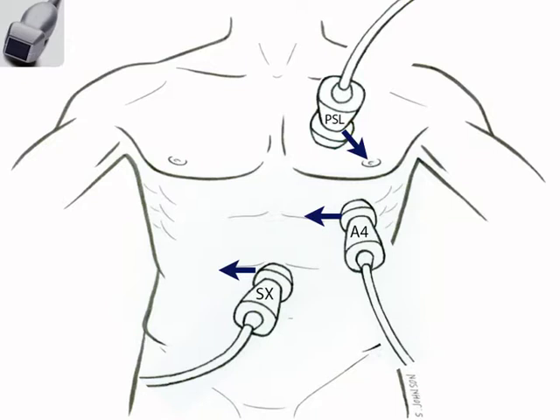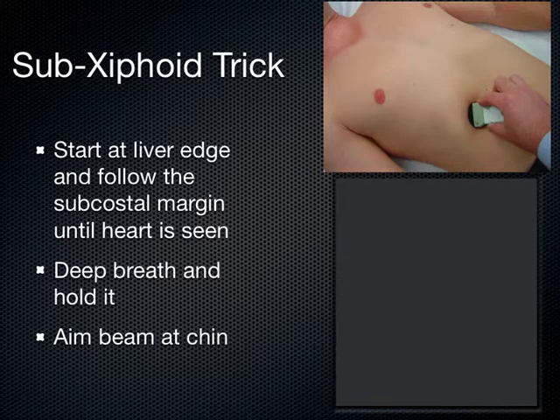We'll start with that subxiphoid view. The interesting thing about the subxiphoid view is that it's probably the one that people reach for first. Certainly the one that I reach for first when I've got a patient in shock. I just want to see if their heart is moving or not, what's going on there. In the setting of a code, is the heart moving? This is the first view I get.